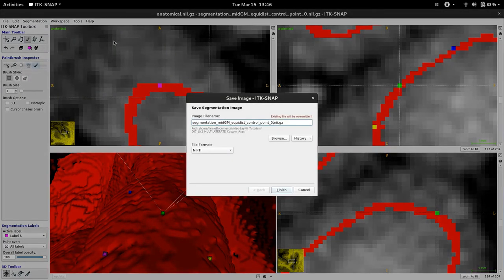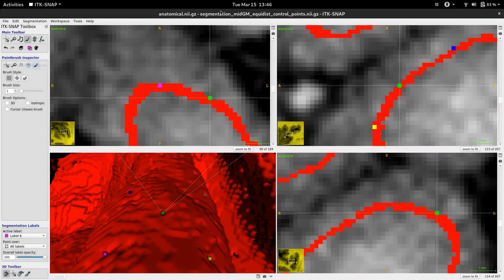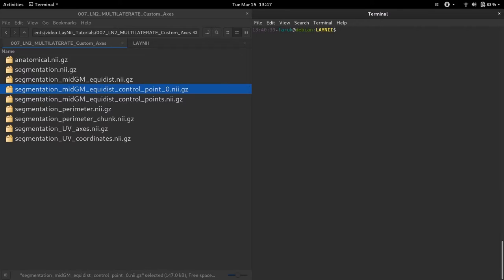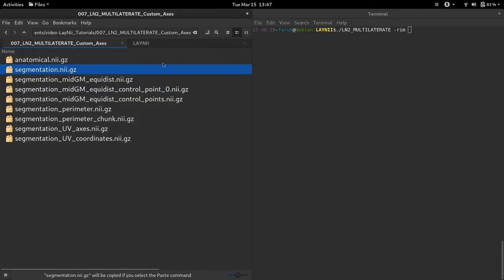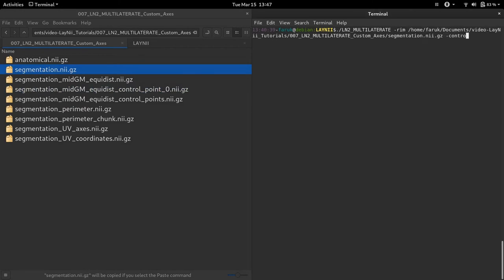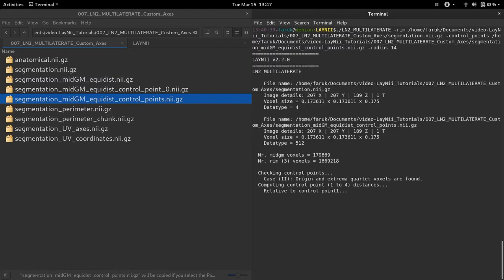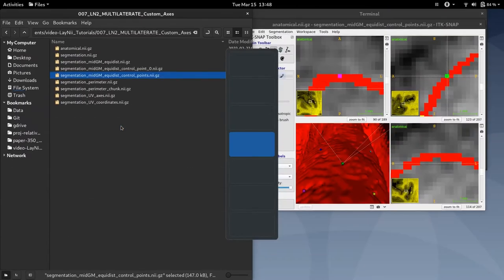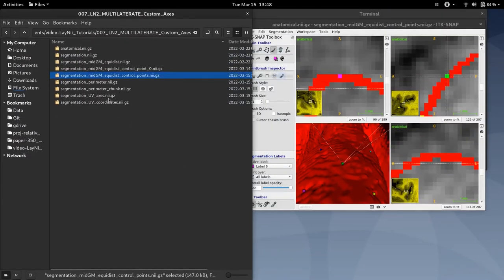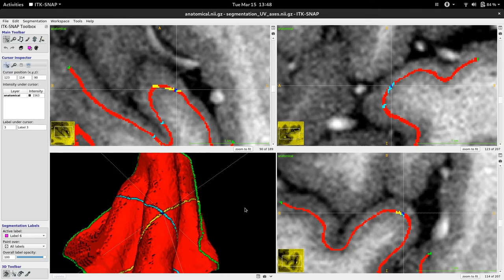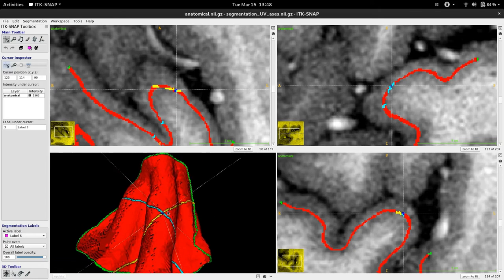Now I am saving my file as the control points file, just changing the name. I will run ln2_multilaterate using this custom axis input, entering the rim file as the standard input, the control points file, and my radius. Now I am running it. I am going to load it and see the difference. As you can see, now I have my UV coordinate axis differently oriented in my region of interest.